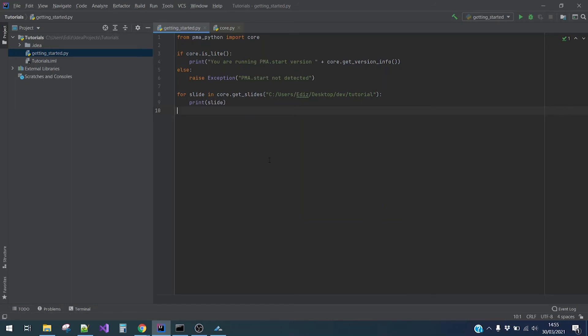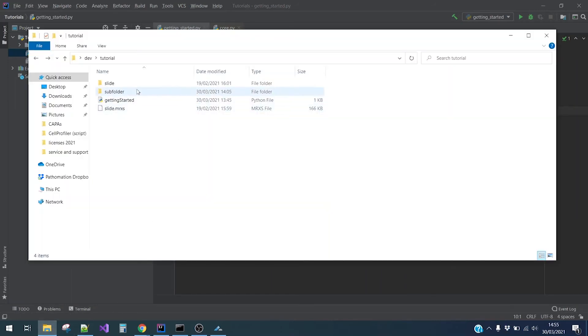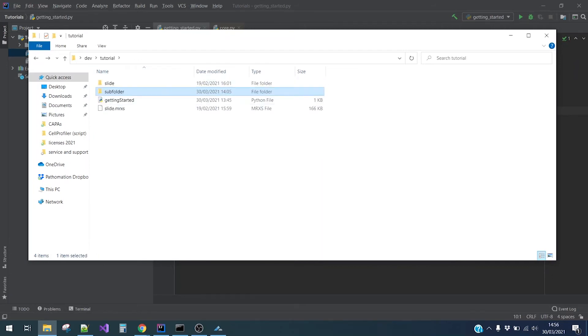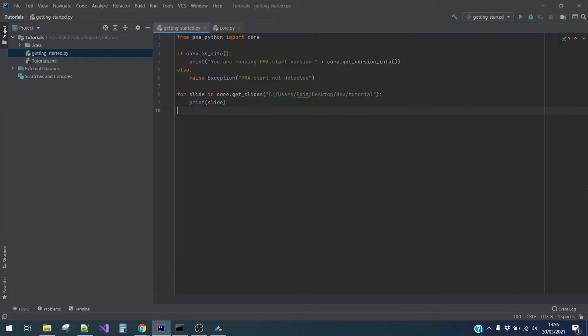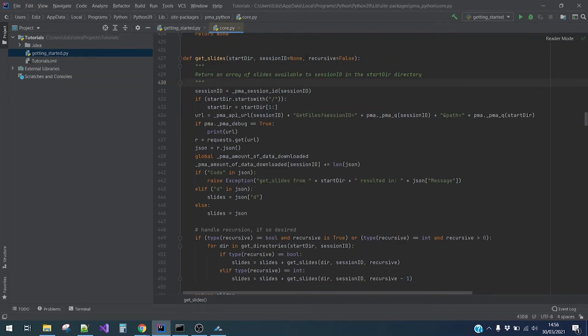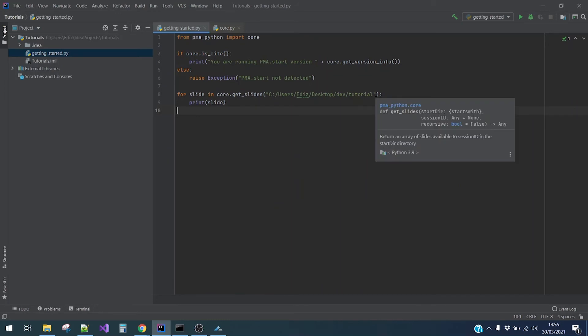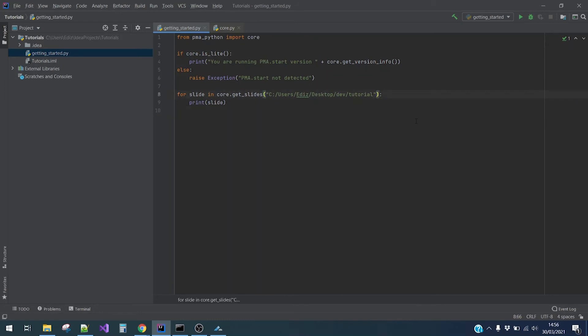But I actually also have a subfolder in which I have a .scn slide. Maybe you have noticed earlier that there was also a recursive parameter in the getSlides method. Let me quickly pull it up in the source code again. So as you can see, there is indeed a recursive parameter that is set to false by default. We will adjust our code by setting recursive to true.